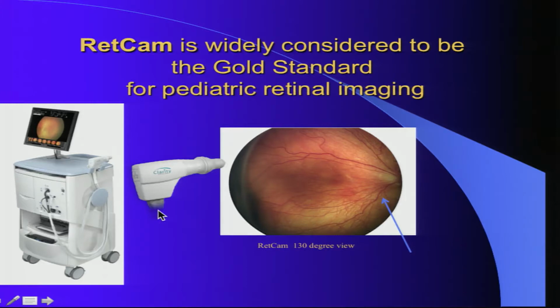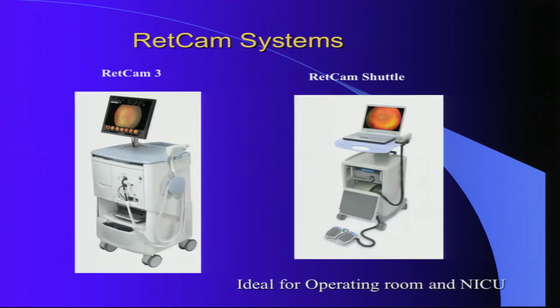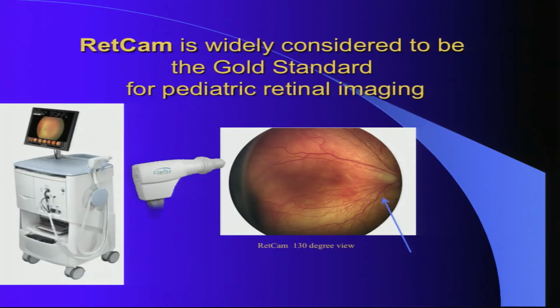Okay. Well, Retcam is one modality which in fact is the only modality where you can image the retina in an infant, and that's how it all started.